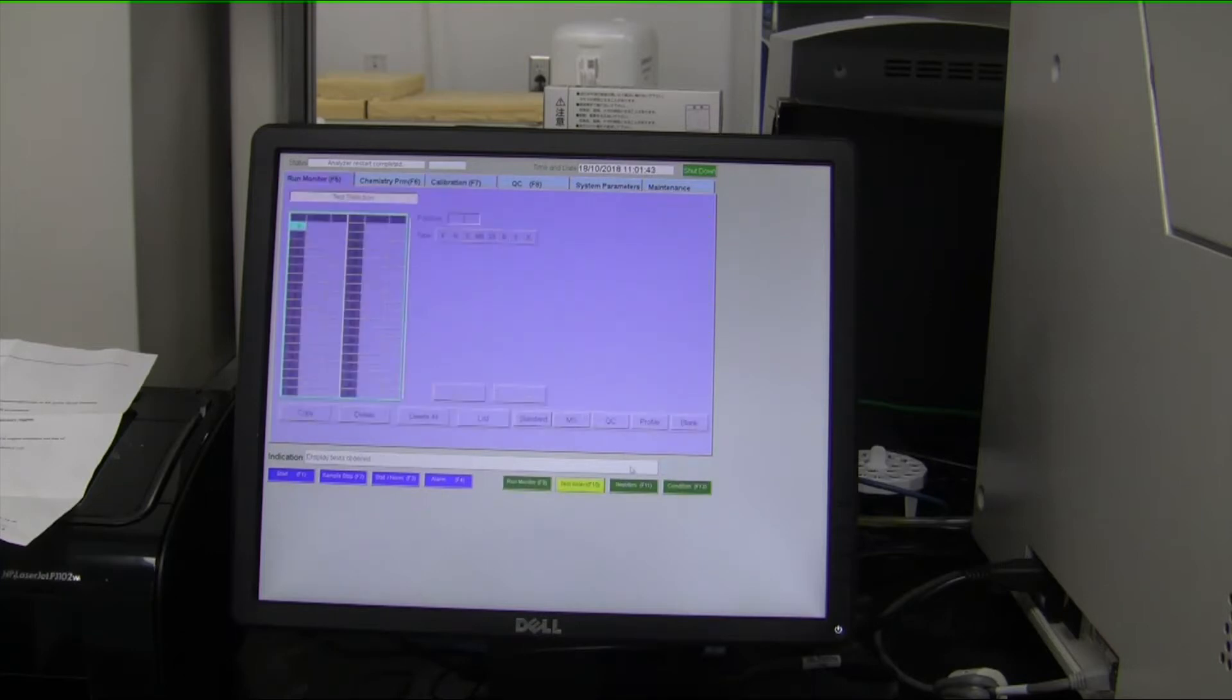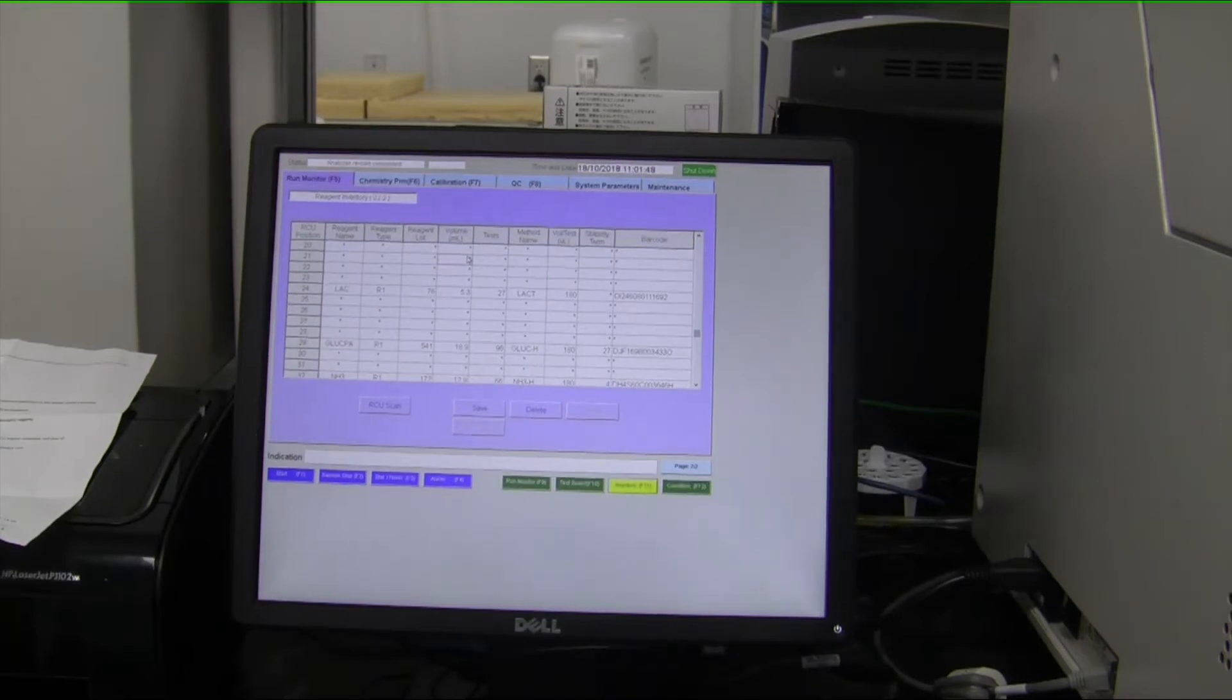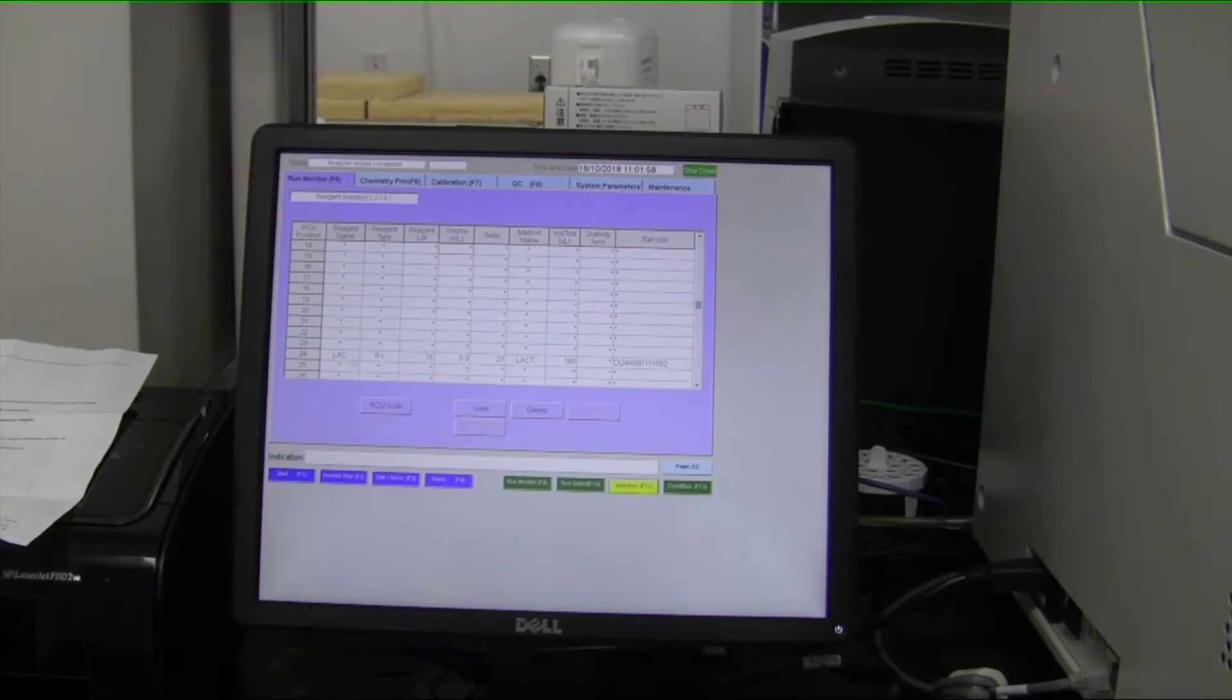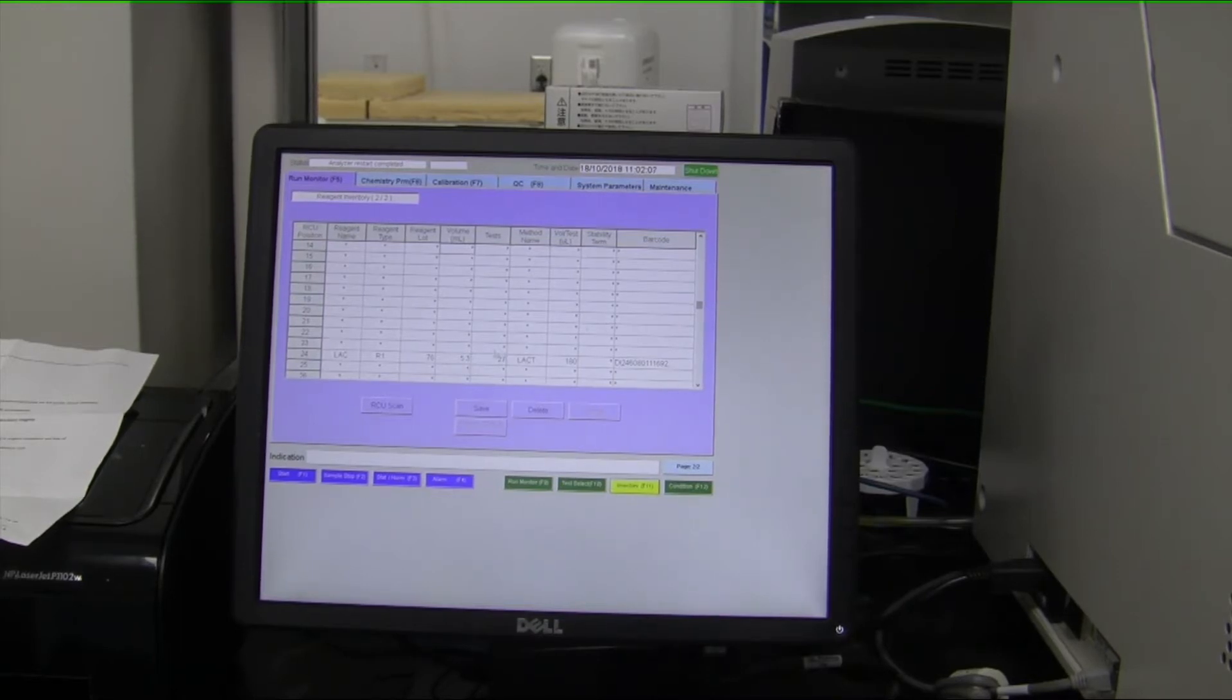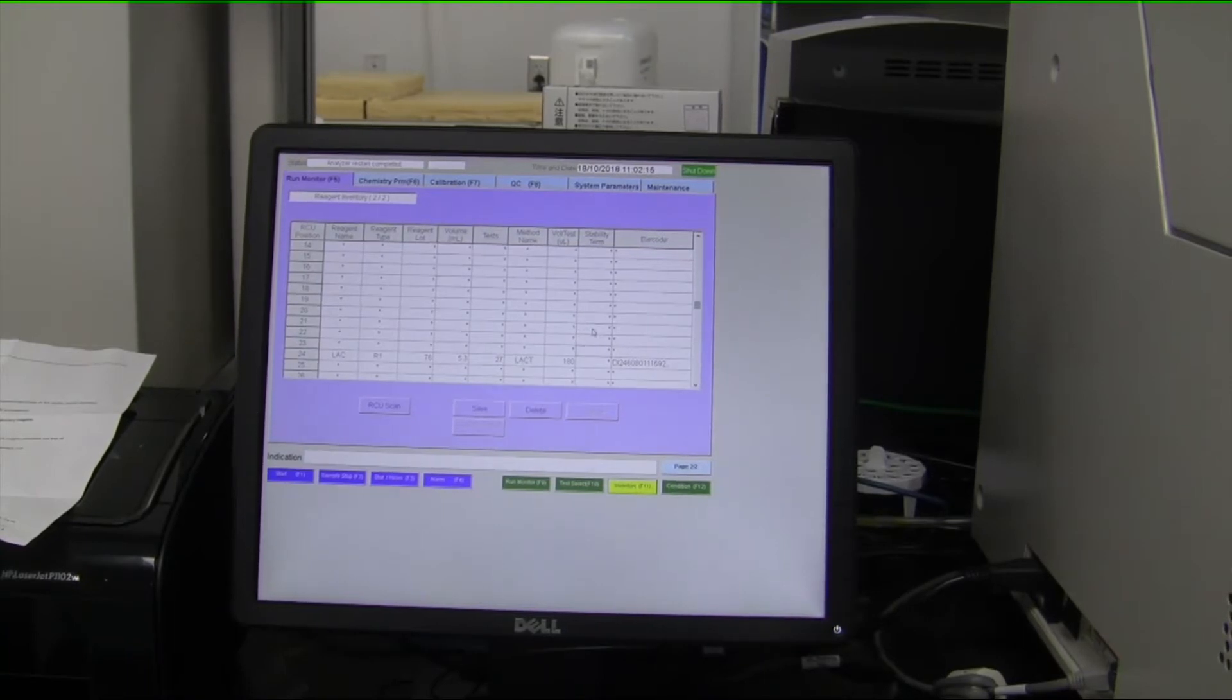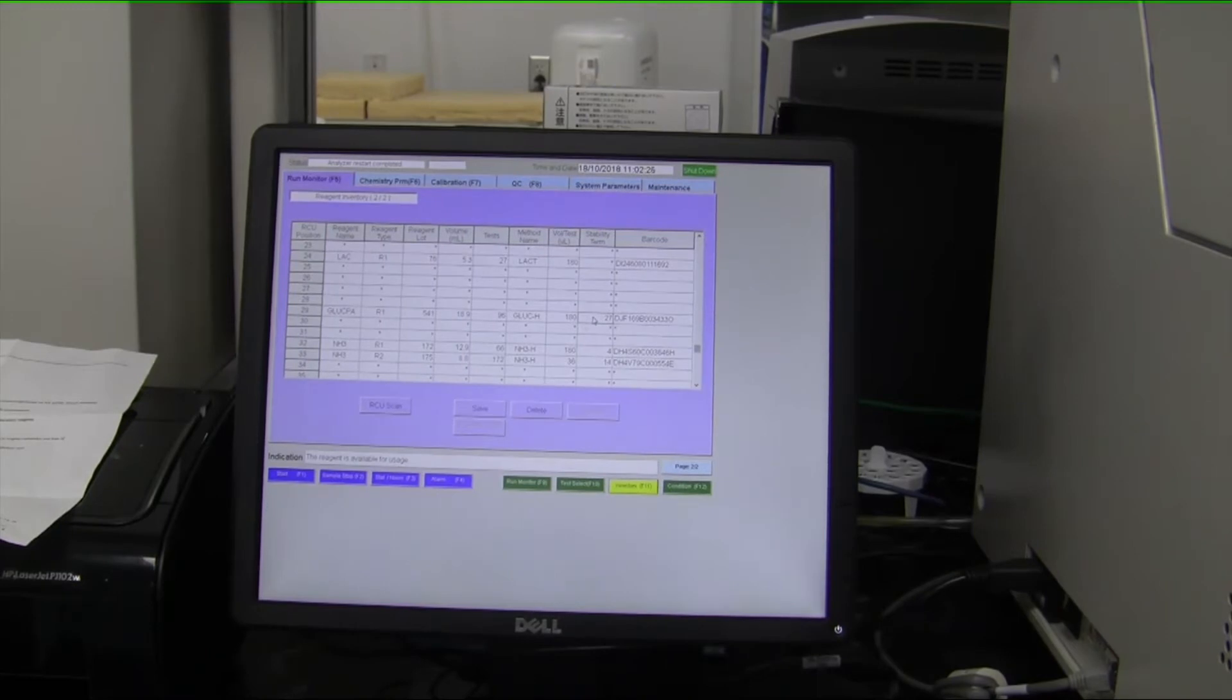If we go back to run monitor and we go to inventory, this is an area that will tell you, based solely upon the barcodes, the position of each reagent bottle, the reagent type—lactate, for example—the reagent manufacturer's lot number, how much volume is left inside of that bottle, how many more tests can be done based upon that volume, and the barcode name. Each bottle will have its own barcode and it'll tell you not only the expiration date but its onboard stability, so how many more days it can be run before it needs to be calibrated or discarded.